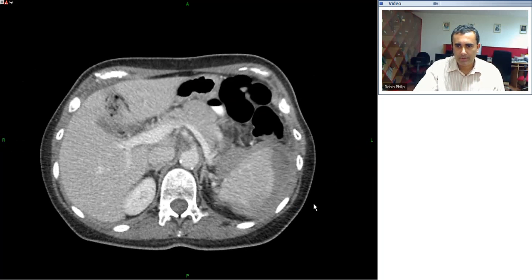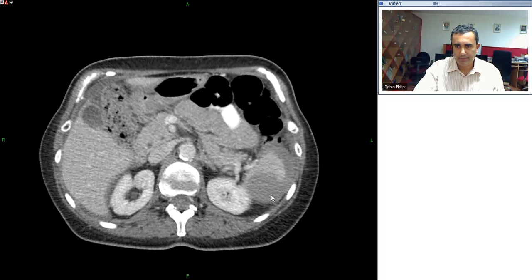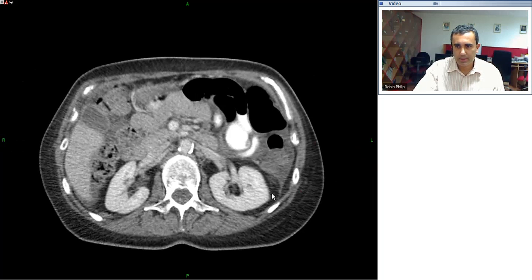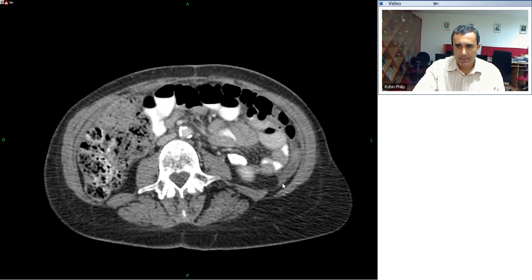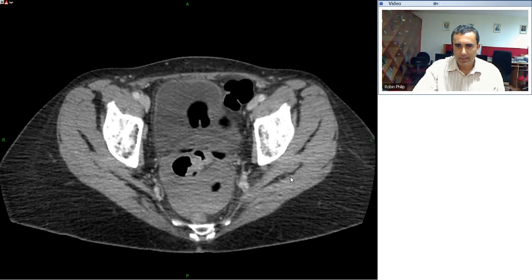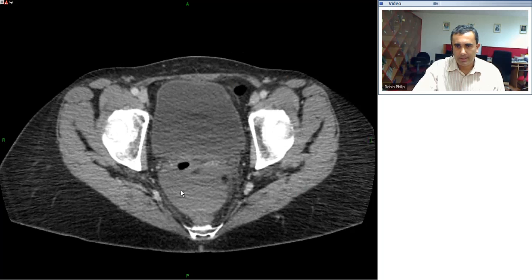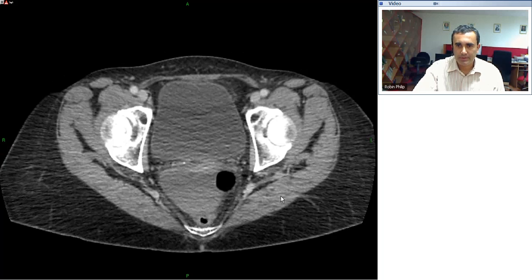Coming further down, we start to see the spleen, which has an irregular contour. There appears to be a collection at the capsule and there's a large defect in the parenchyma. As we follow the scan down, there's a small amount of fluid in the left flank as well, and there's a collection of fluid in the lower pelvis in the region of the cul-de-sac.